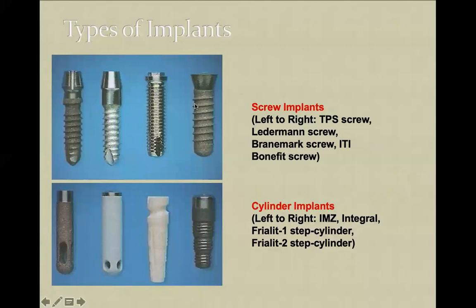Yeah, so the threads will create primary mechanical stability, and this design is more or less, let me say, a frequent design.